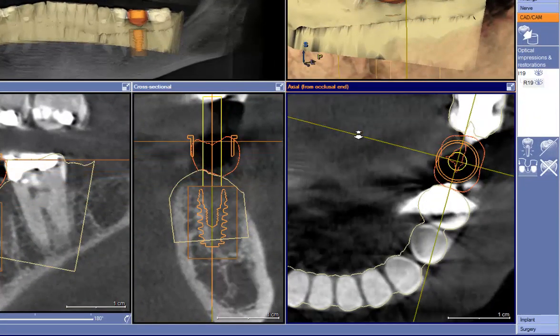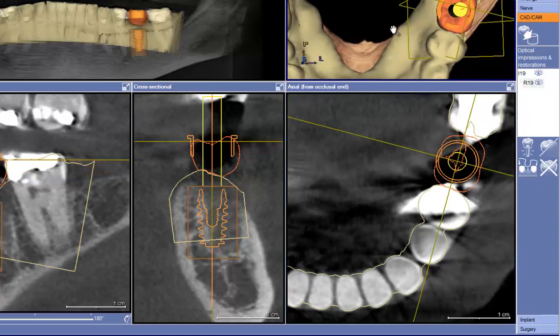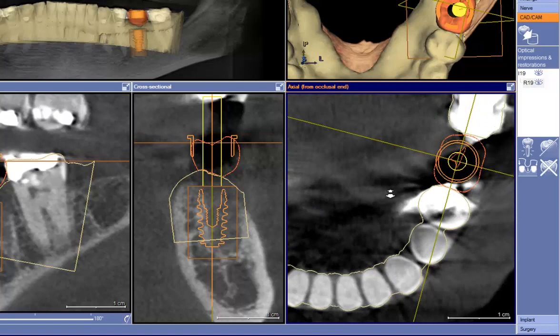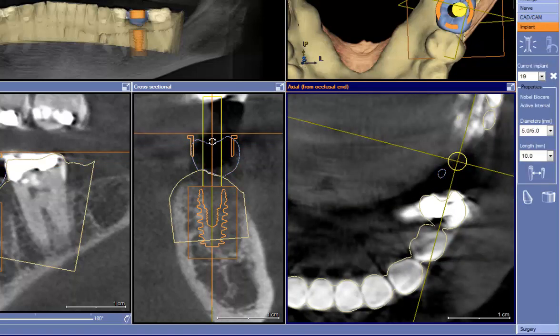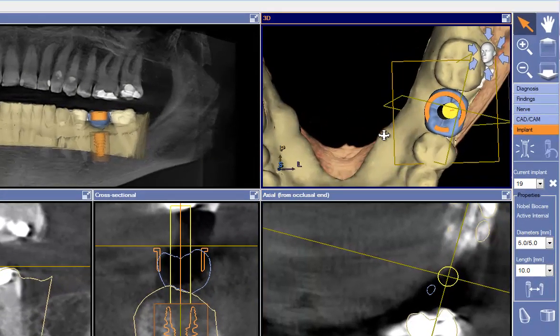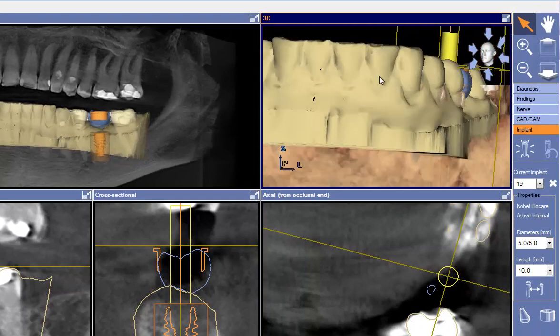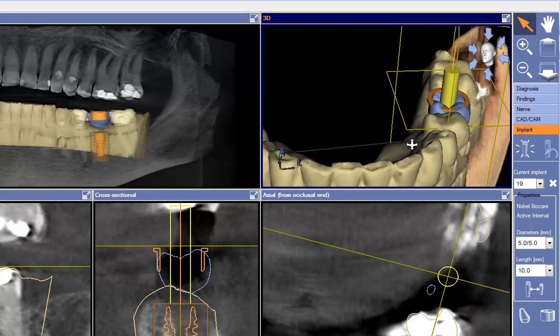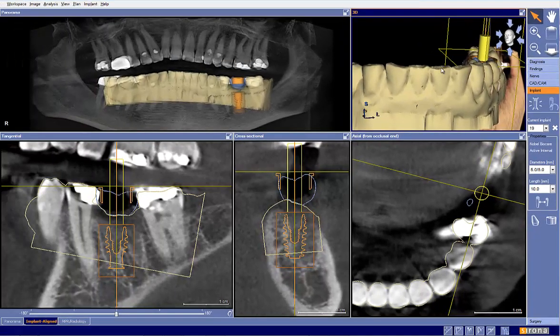The next thing we'll look at is the occlusal table. Looking at the occlusal table here, we can see that our implant is pretty well centered. We can see that it comes through the central groove, so that looks very nice. The other thing that I'll look at with the occlusal table, and I didn't really talk about this very much in the workshop, I touched on it briefly, is I'll look at this down the line.